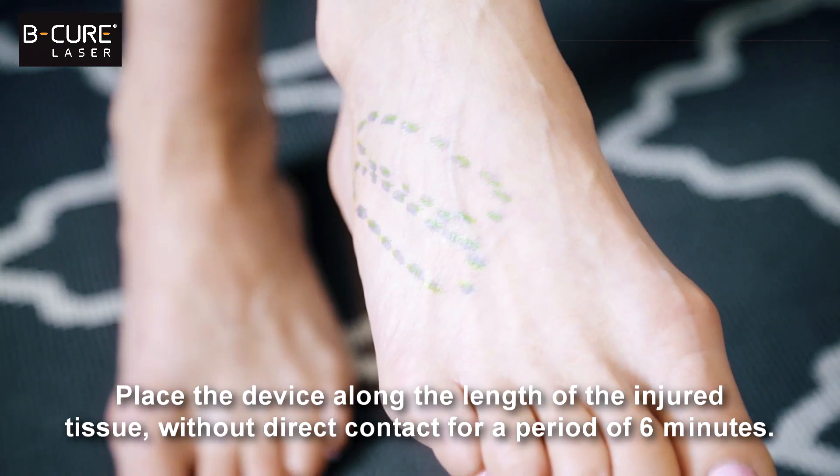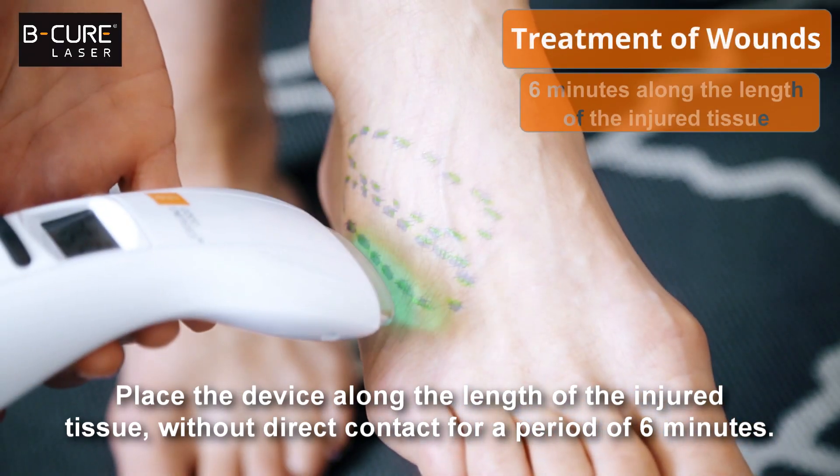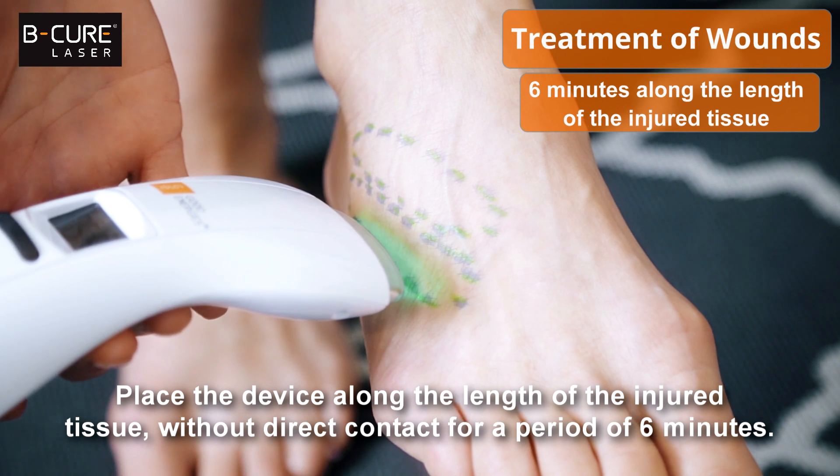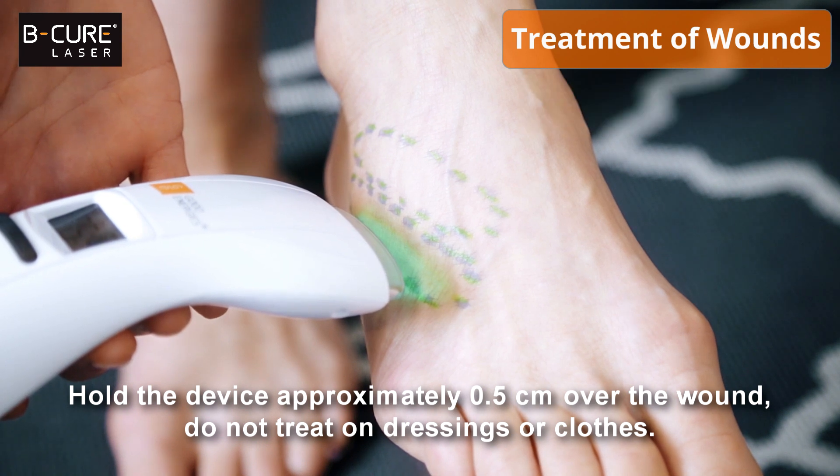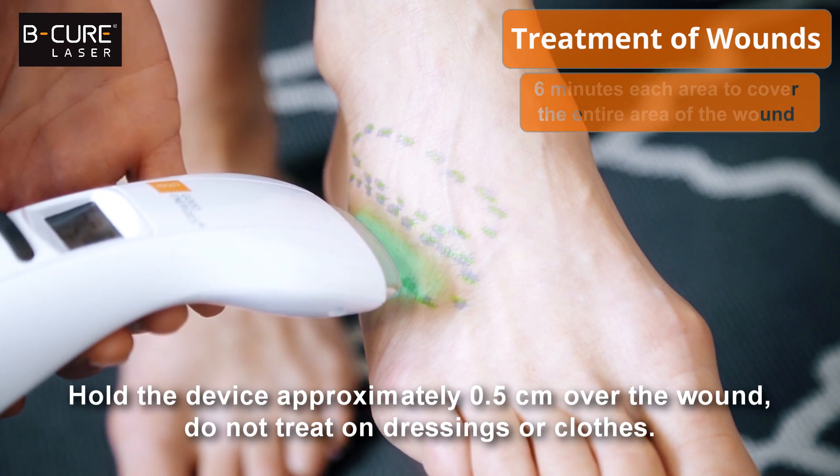Place the device along the length of the injured tissue without direct contact for a period of 6 minutes. Hold the device approximately half a centimeter over the wound. Do not treat on dressings or clothes.